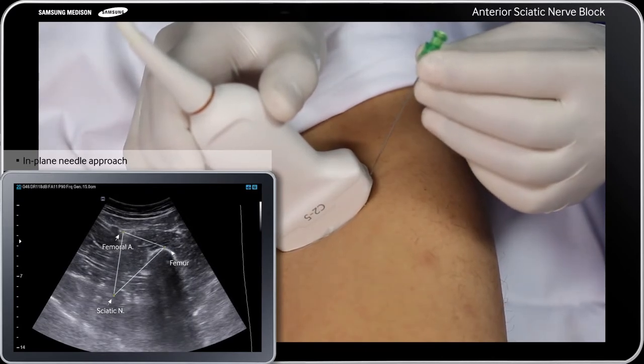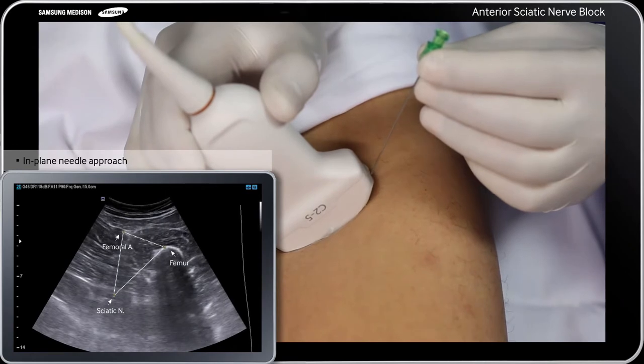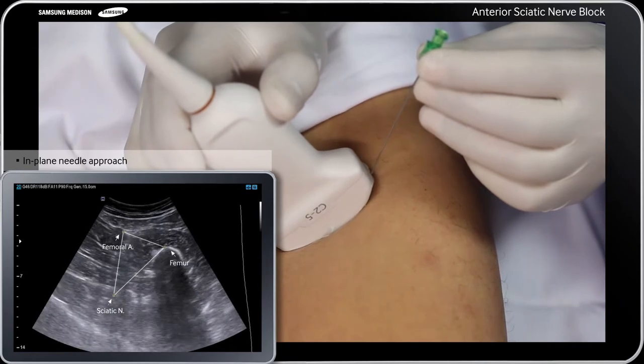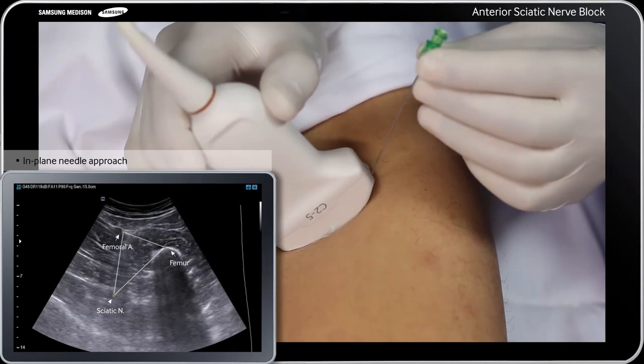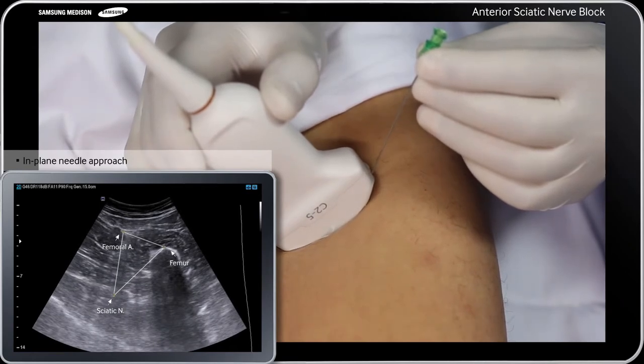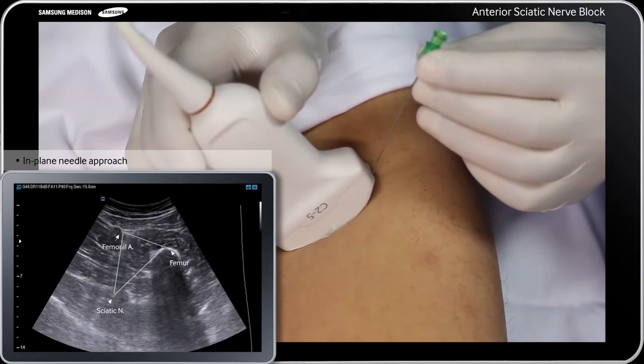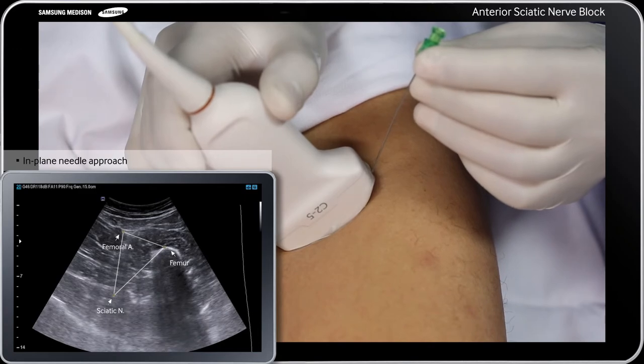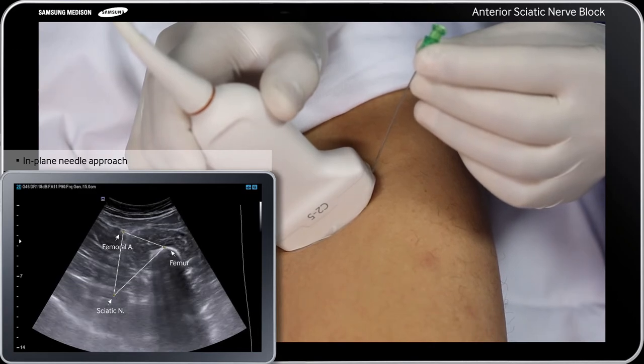Then, advance the needle along the long axis of the transducer in the same plane as the ultrasound beam.